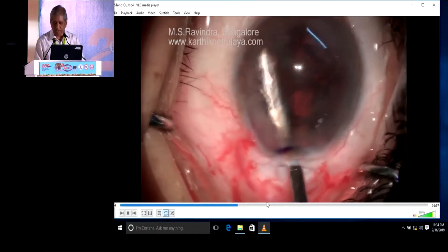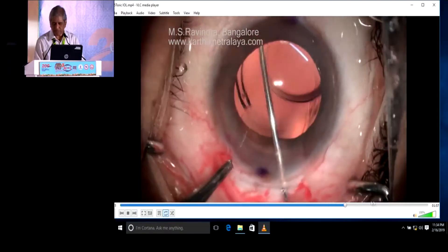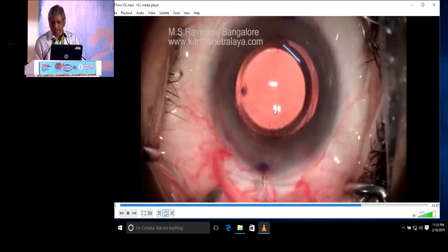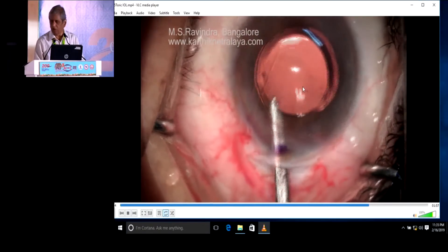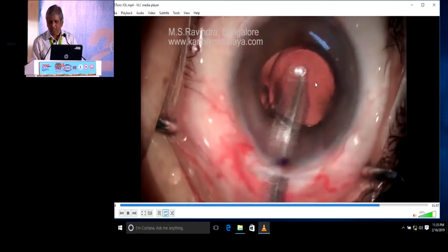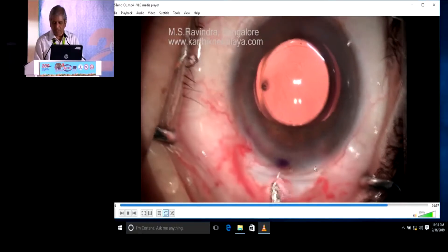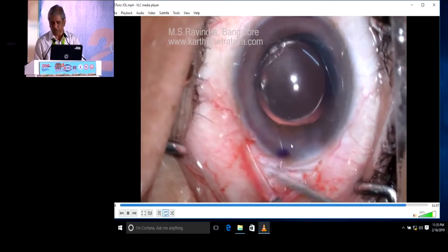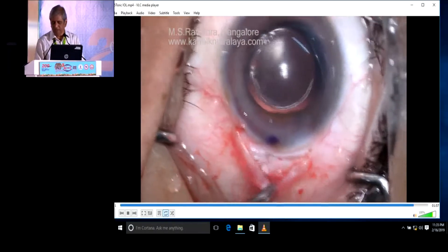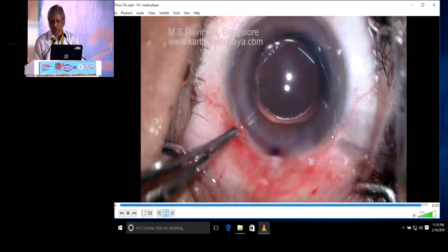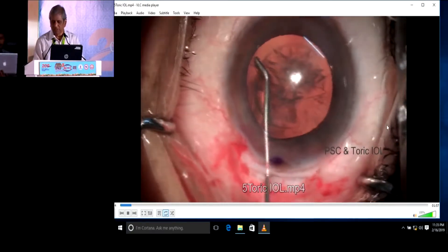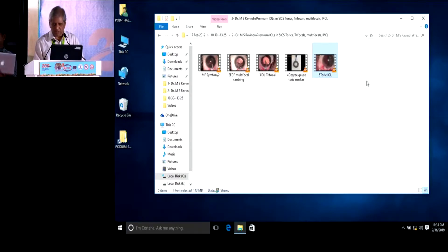You can position the toric lens and ensure that the axis is correct to the axis that you have marked. Because there is no ring, you cannot ascertain that it is exactly fixed to the Purkinje 1 image. Astigmatism you can make 0, 0.2, or 0.4, depending upon what you do with the tunnel and where you situate it. I always close my conjunctival tenons with fibrin glue so that there is no exposed wound. This is the finest surgery you can do.